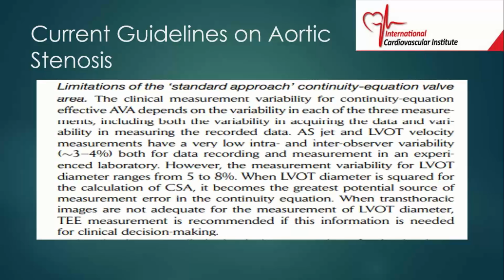It has been shown that clinical measurement variability for the continuity equation, the effective area, depends on the variability in each of the 3 measurements. For the aortic jet, there's not much variability.